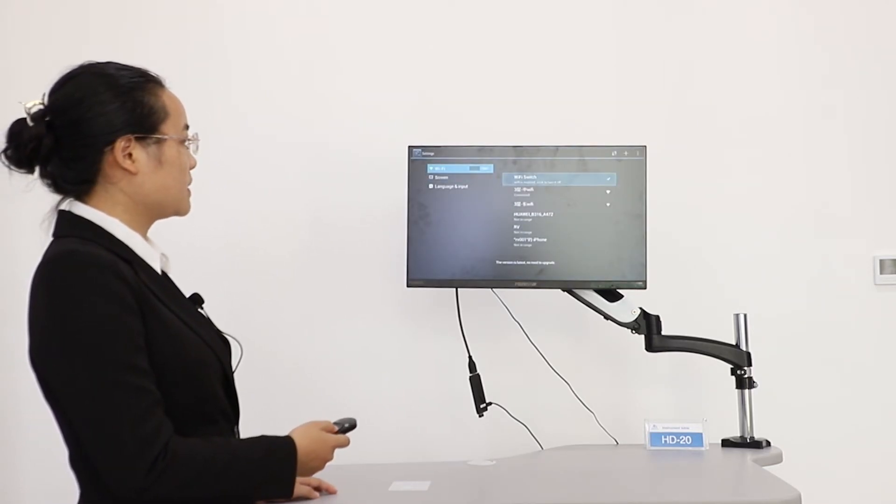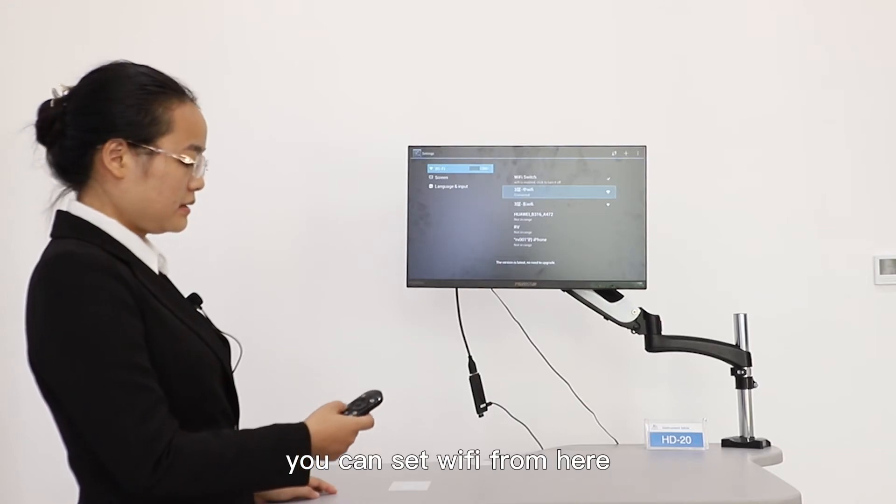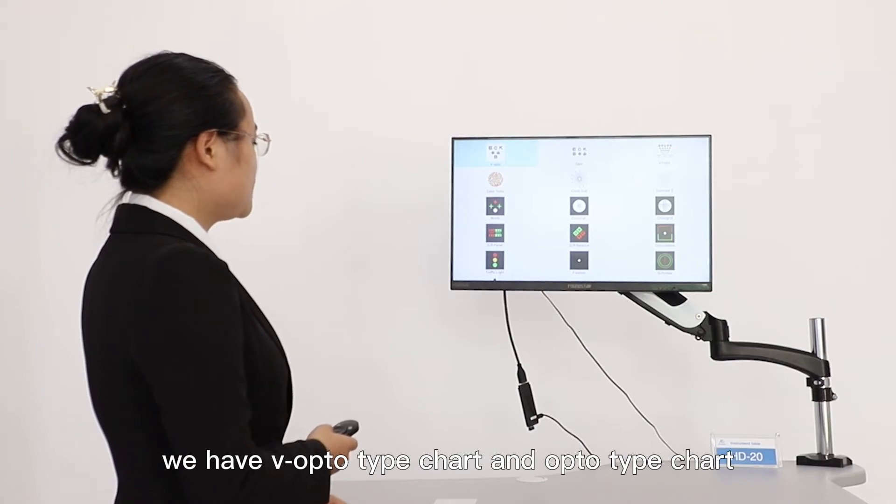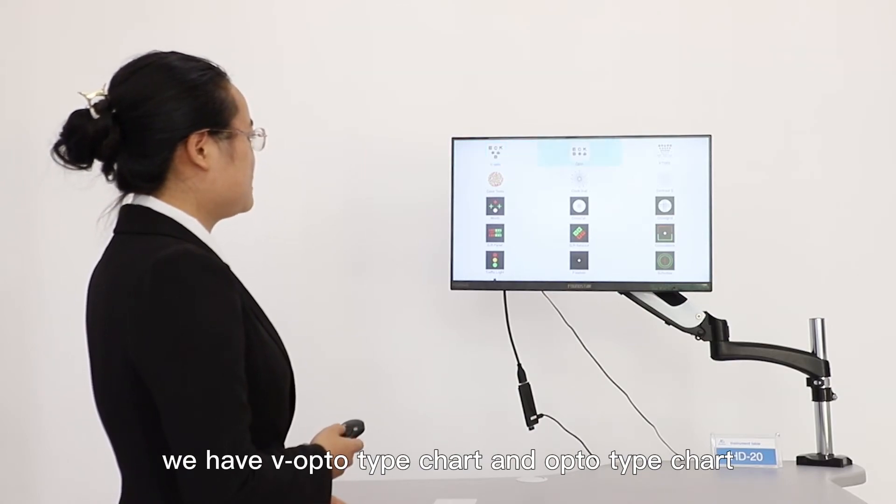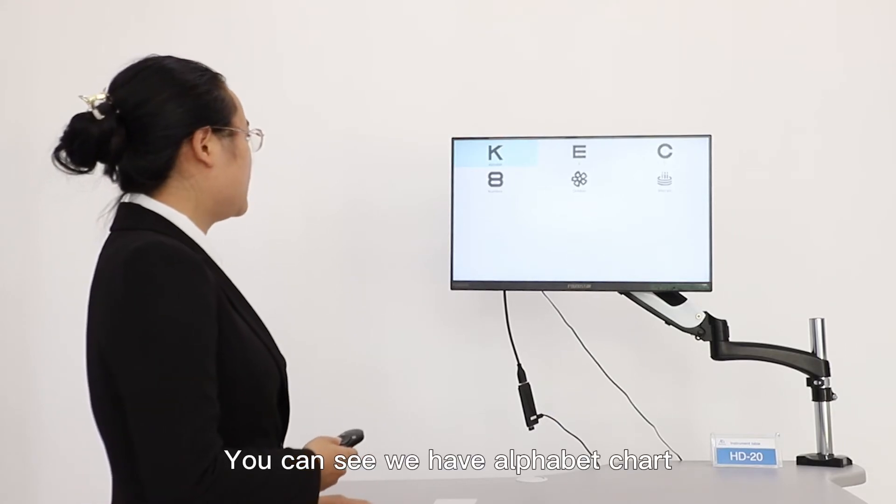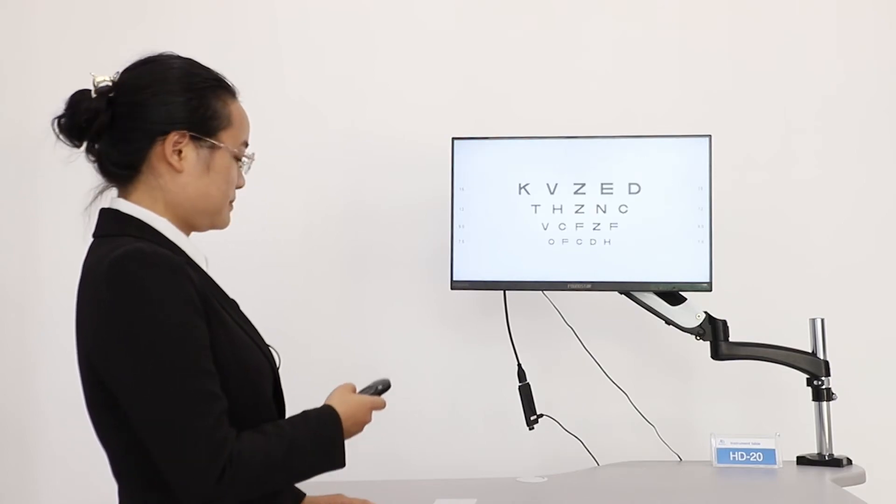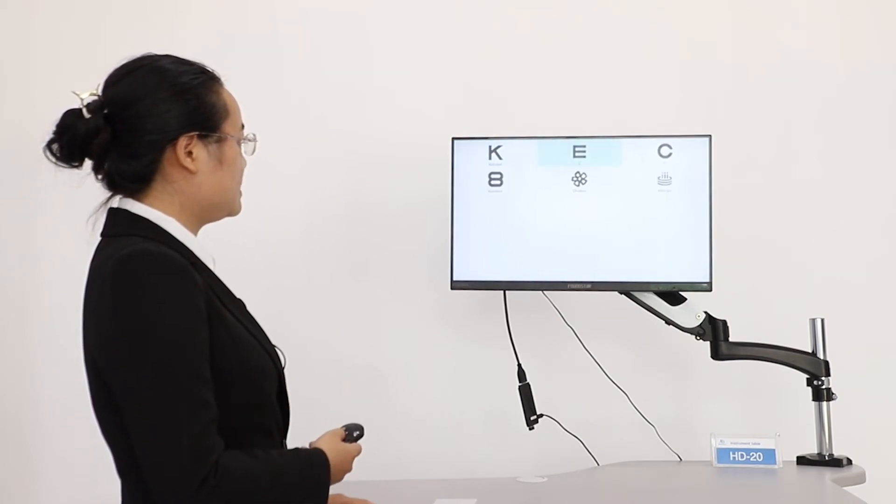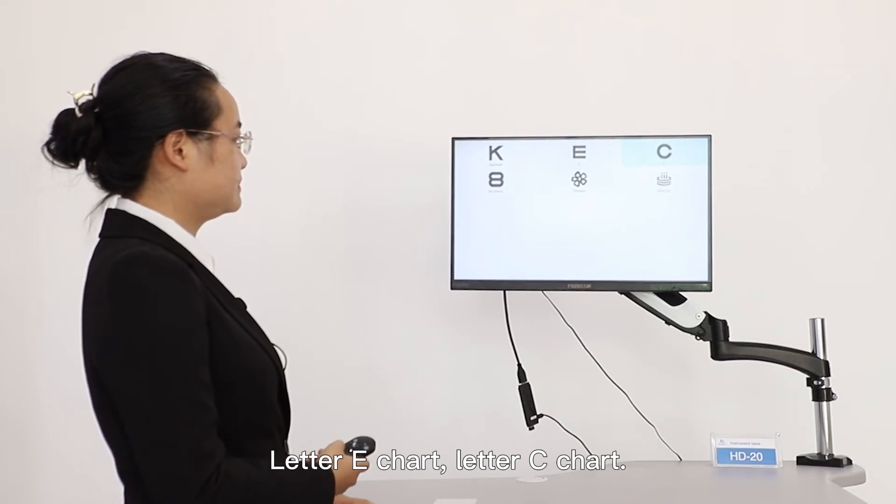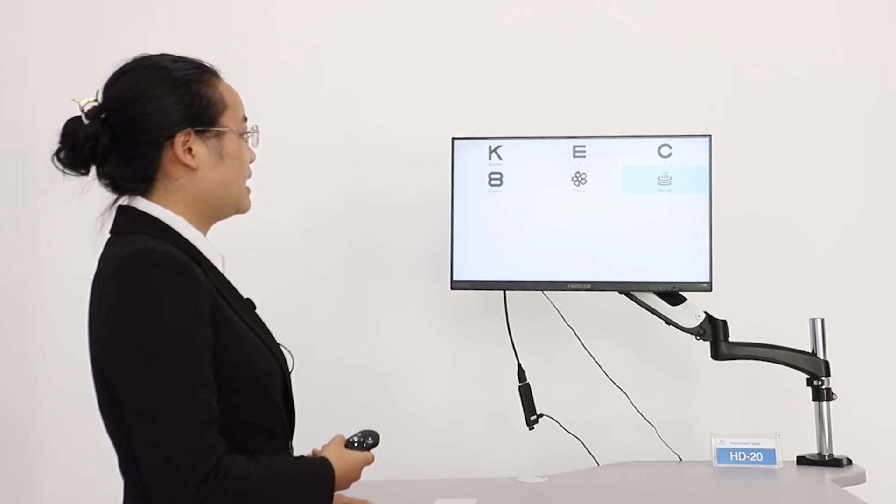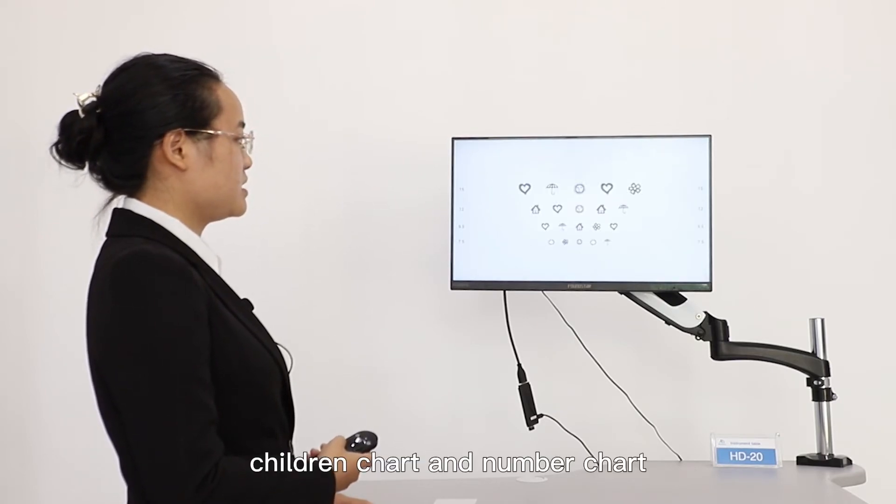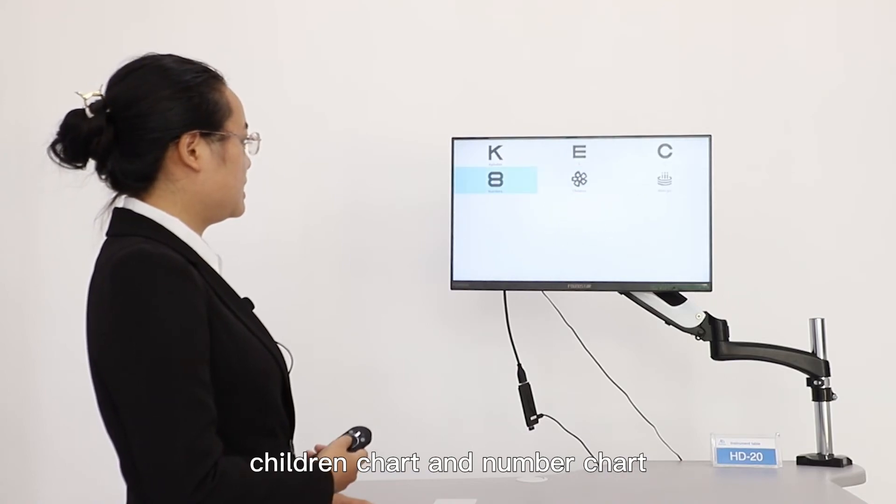As you can see, you can set WiFi from here. For vision chart, we have V-optotype chart and optotype chart. Here you can see, we have alphabet chart, letter E chart, letter C chart, element picture, children chart, and number chart.